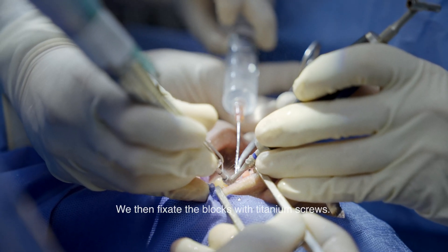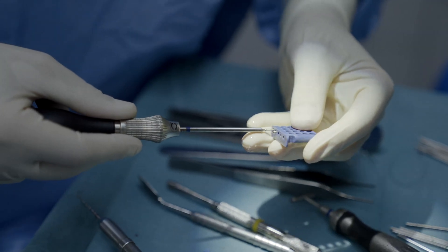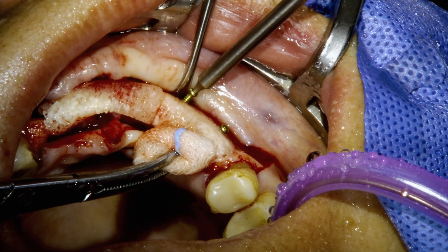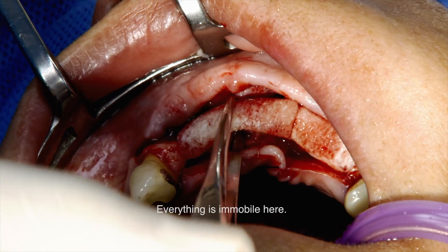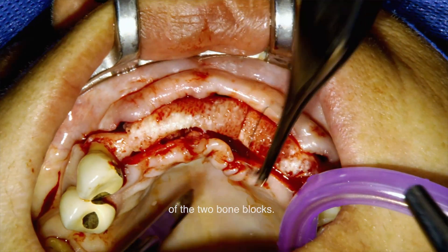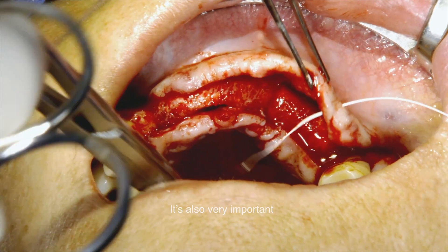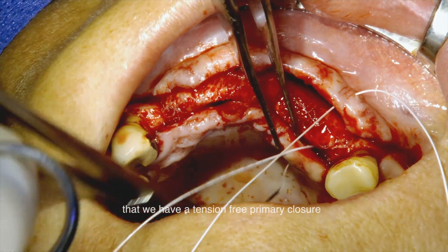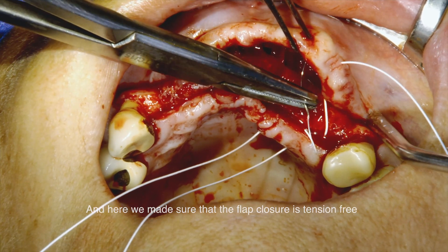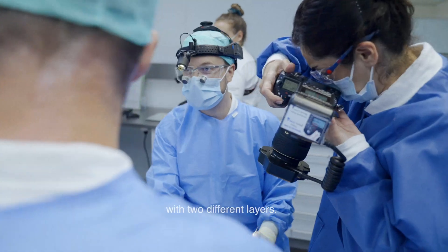We then apply the blocks and fixate them with titanium screws — approximately 1.2 millimeters are used here, though 1.5 millimeters can also be used. It is very important to achieve rotational stability of the two bone blocks, and to ensure a tension-free flap covering them. The flap closure must be primary and tension-free, performed in two different layers.